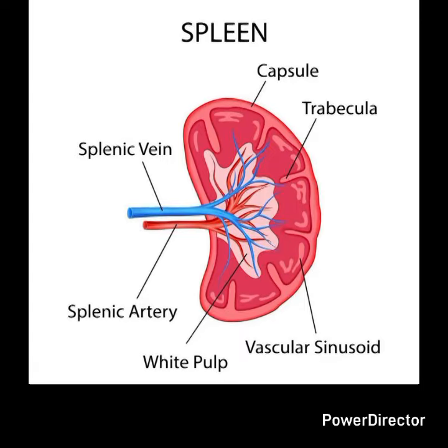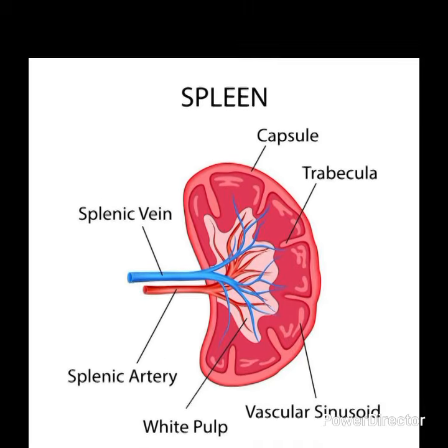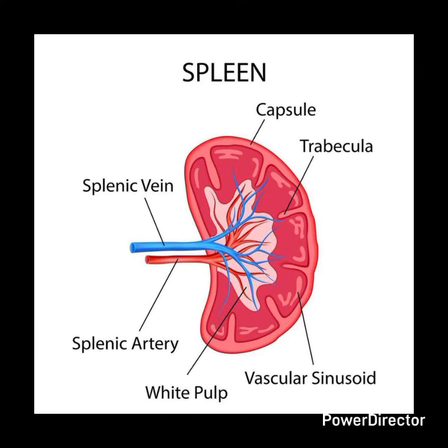Hi, this is the second part of the splenic artery embolization video, and in this we discuss techniques and procedure. Coming to techniques, splenic artery embolization is classified into two main approaches. First one is proximal splenic artery embolization.